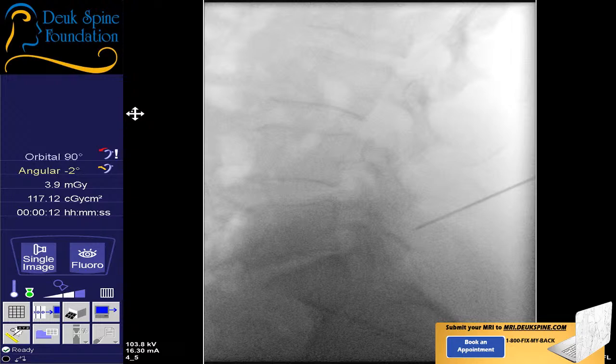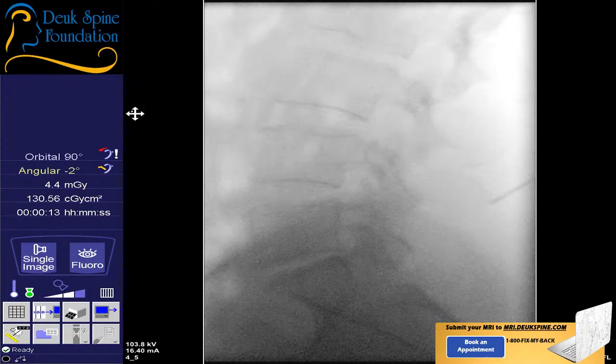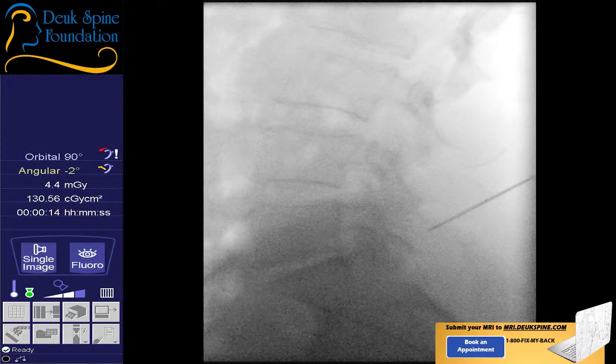Okay? So I'm up against the facet, and I'm not able to get past it. So I'm going to have to adjust what I'm doing a little bit. Shot. Shot. She's nice and comfortable.